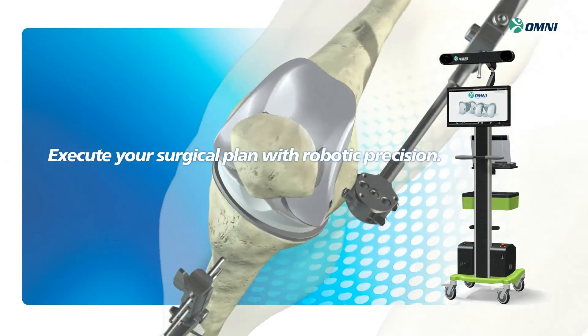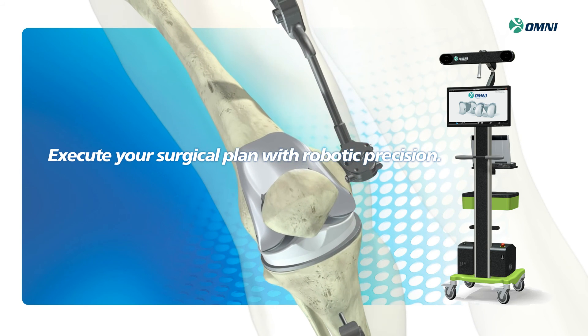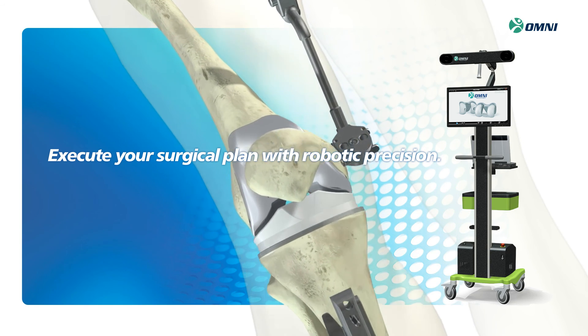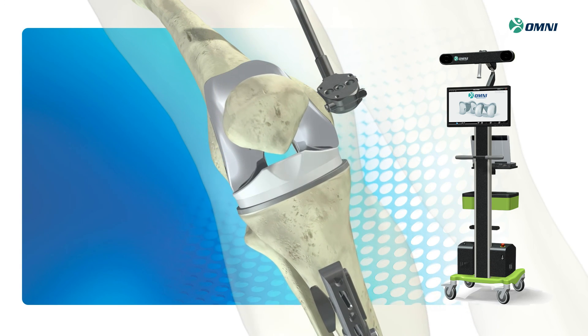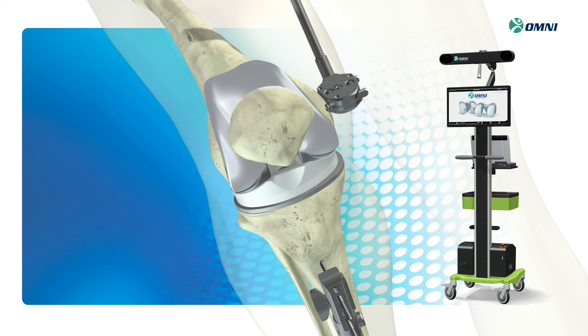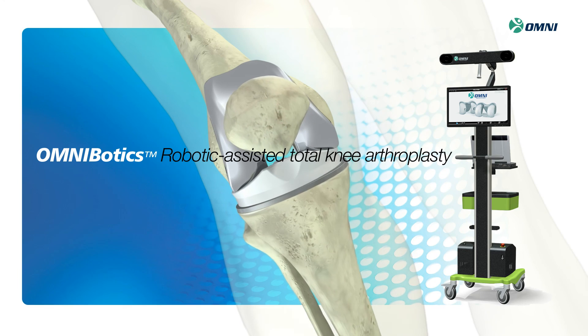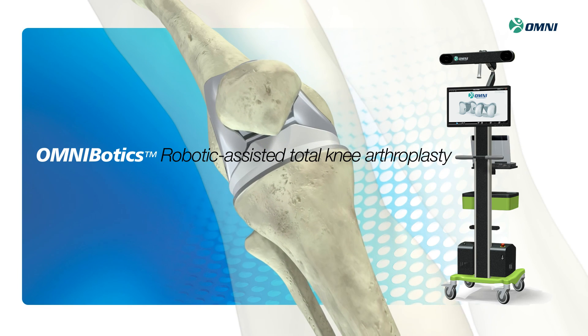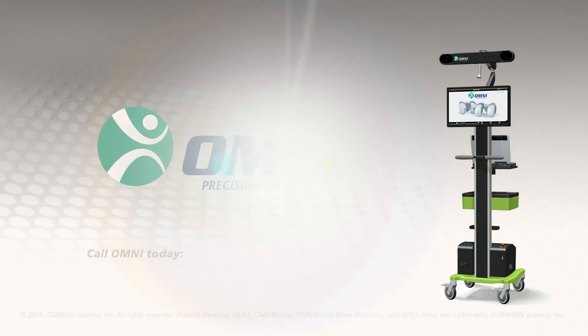Execute your surgical plan with robotic precision. The quality of total knee replacement is heavily dependent upon a plan that meets the anatomical needs of the patient, and that execution of the plan is made with precision and accuracy. The Omni robotic-assisted system, exclusive to the Apex knee, helps you meet this objective in each and every procedure.